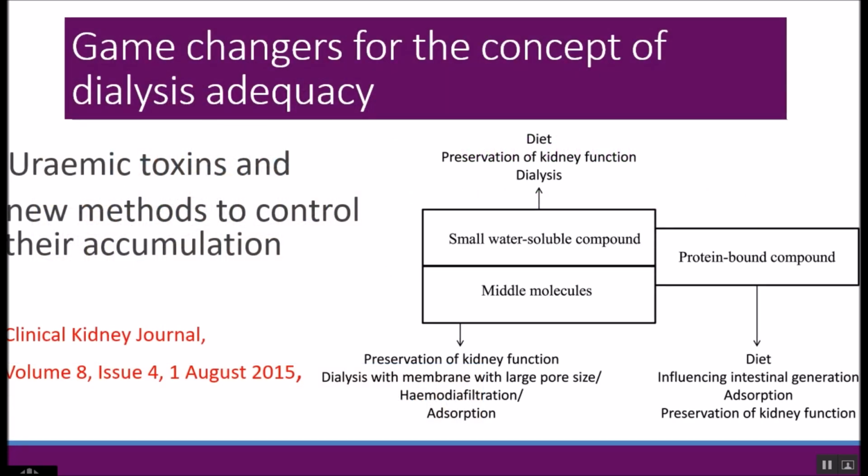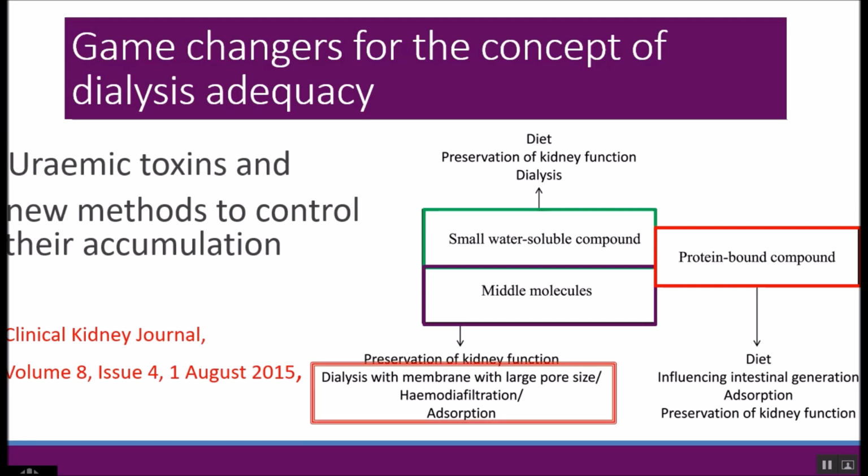Game changers for the concept of dialysis adequacy. Not only for small water-soluble compounds, going to middle molecules, probably you can remove more protein-bound toxins, preservation of the kidney function, and dialysis with a membrane with larger pores, you can do hemodiafiltration, and improve the diet of your patients.